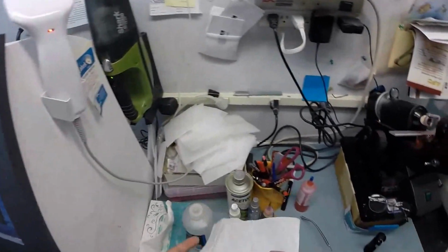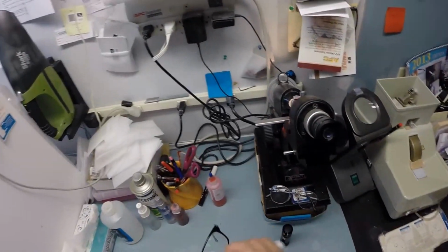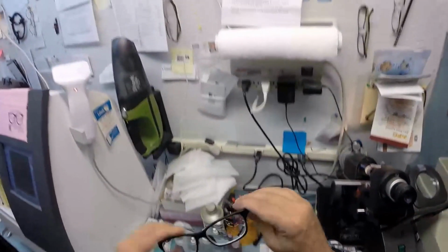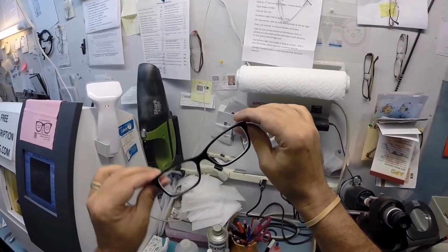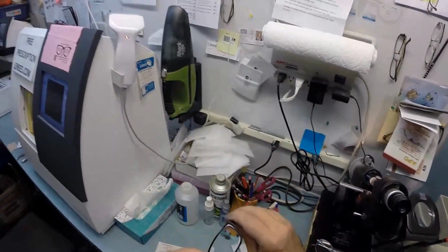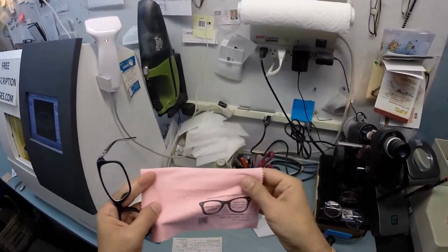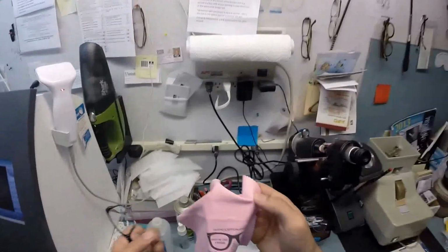Now this is the point in every video that I explain that when you get these in the mail, there's a very small chance that these could fit too loose or too tight. However, there's an 80% chance that one side is going to sit higher than the other. And that is because 80% of people have one ear that is higher than the other, and because of that, 99% of all optical shops will do free adjustments if you ask them.